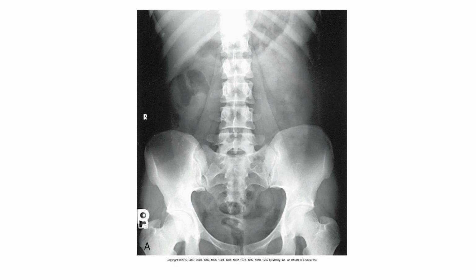That's all basically solid white there. And then you can see the air in the stomach crossing the spine at L1. You can see the stomach shape there as an air bubble. The spleen, we just know by difference, is to the far left, so in the upper left-hand corner. That gray color that matches the gray color of the liver, that's the spleen.